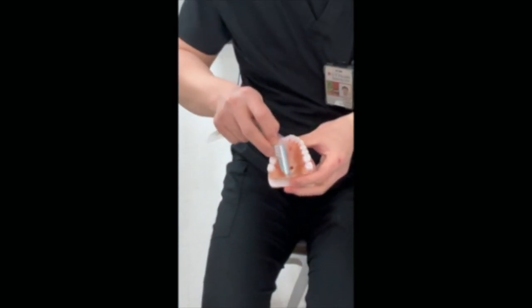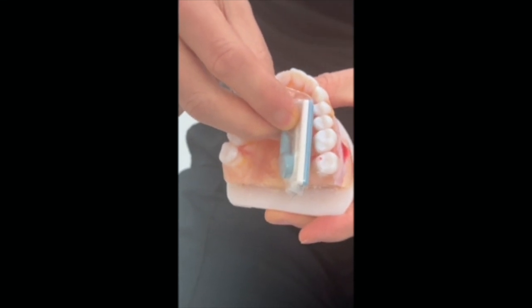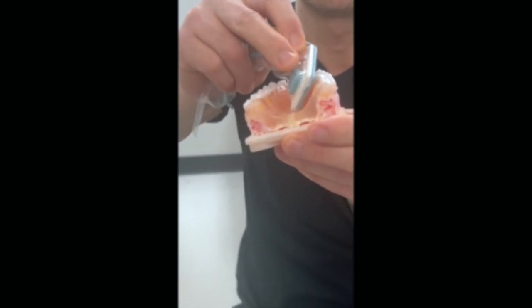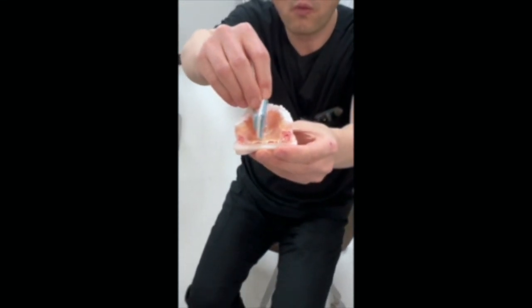So when taking the radiograph, it's important not to push the sensor necessarily close to the teeth. It's not as effective when you just push it to the teeth. It's difficult to get a vertical angulation. It can hurt the patient. You want to place the sensor into the center of the mouth and take advantage of the palatal space. As you can see here, you can place it away from the tooth, and then you can change the angulation as seen.